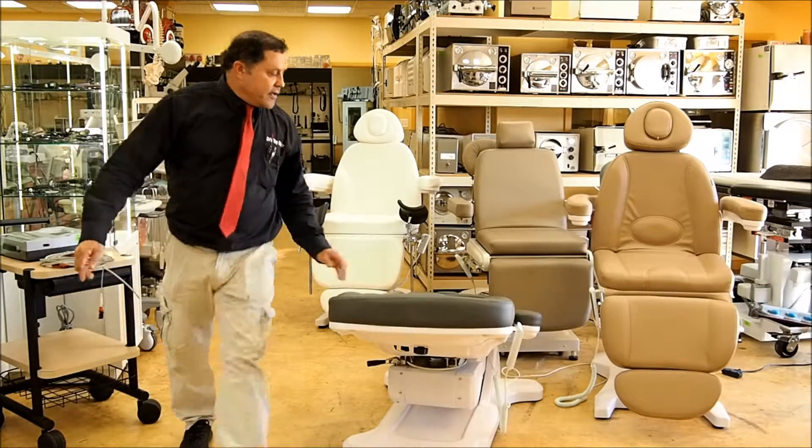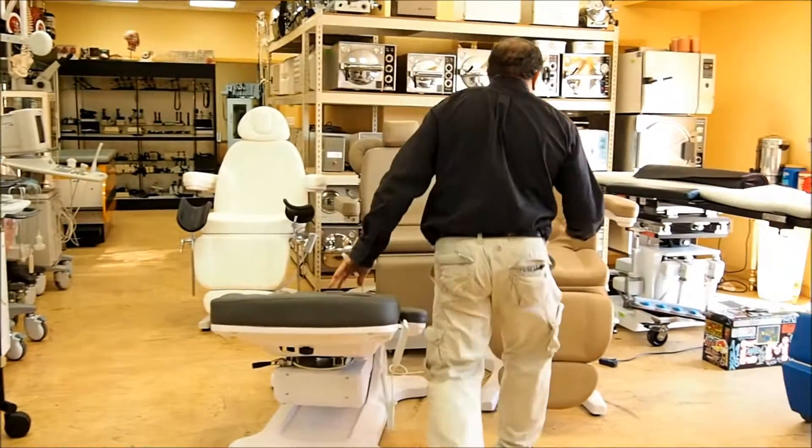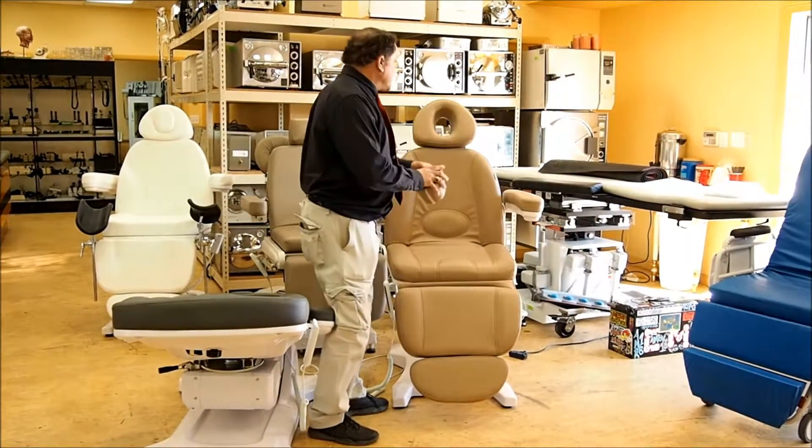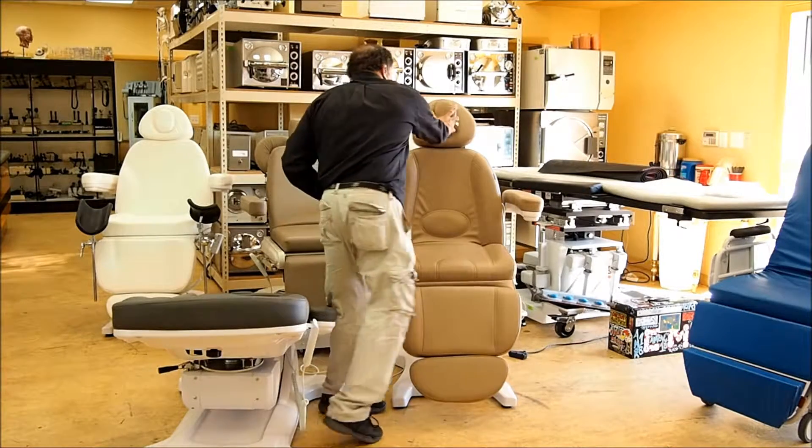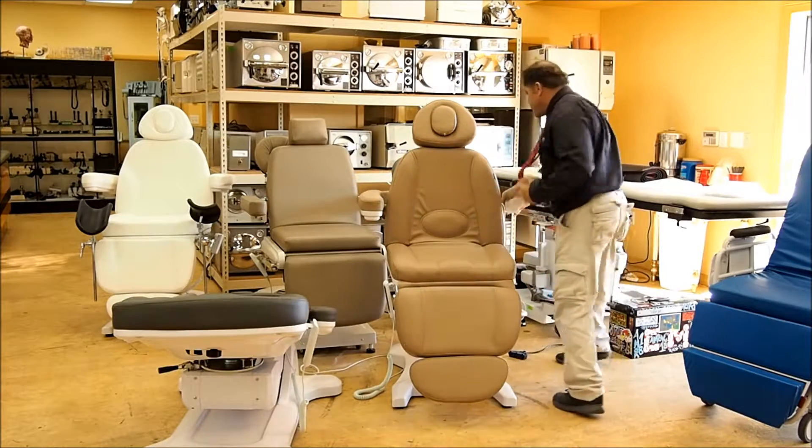Another feature you'll see is this face cutout. So if you want to put the patient face down and do hair removal, you've got that option. The arms on all the chairs pop right off.